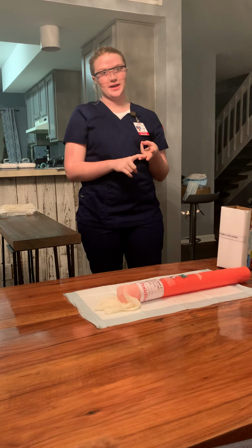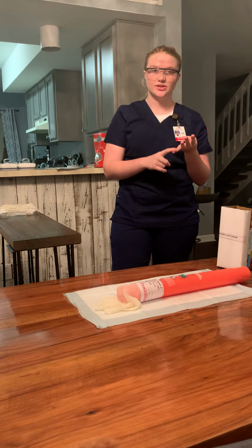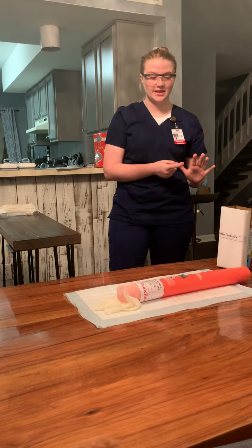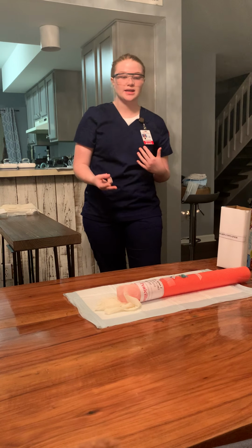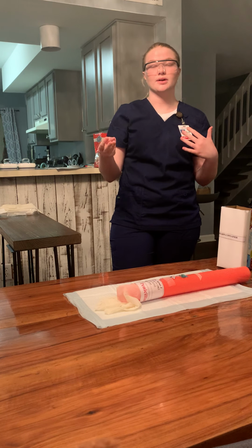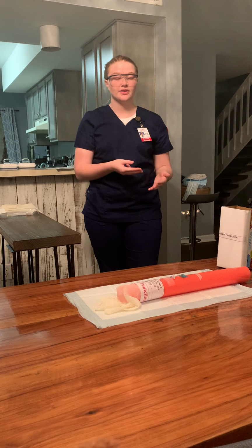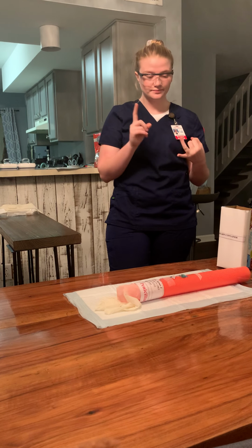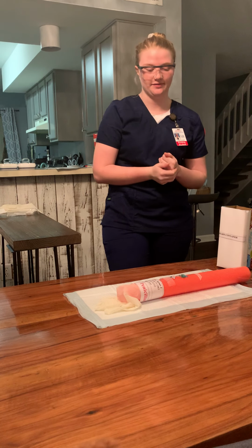the time, the location where the IV was inserted. I would document the number of tries it took to get the IV inserted. I would document the length and the gauge of the needle. I would document the patient's tolerance to the procedure. I would document if there was a saline lock present, and I would also document if they were receiving fluids. I would document the flow rate and the method of the insertion of the fluids.